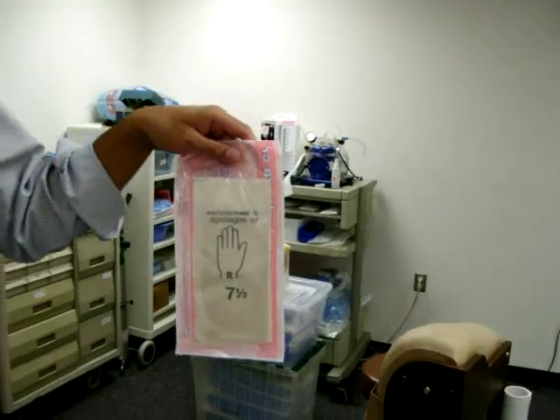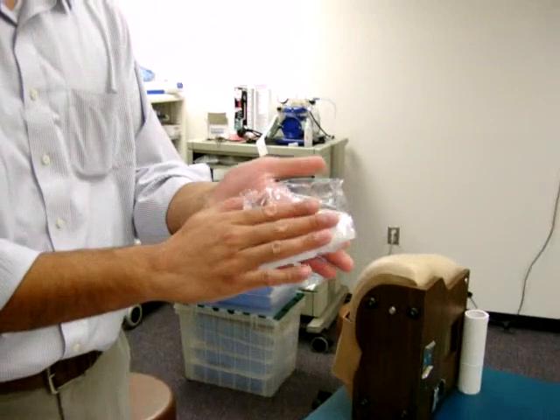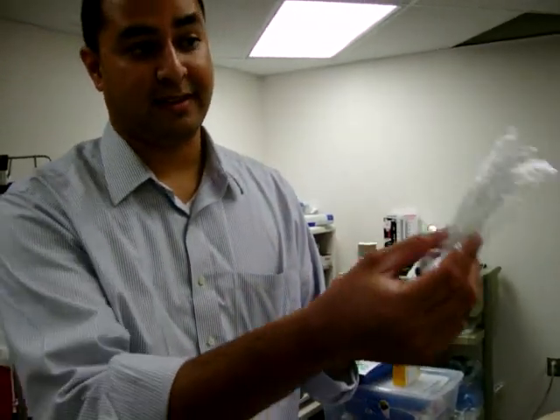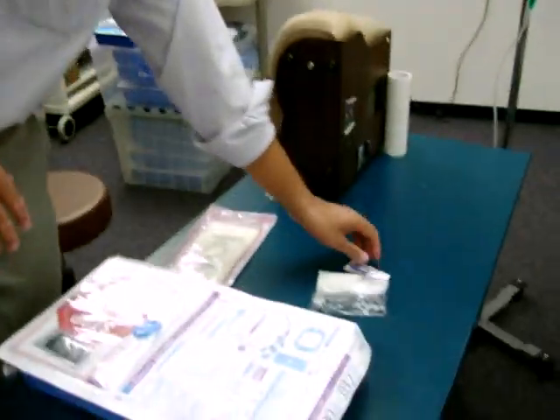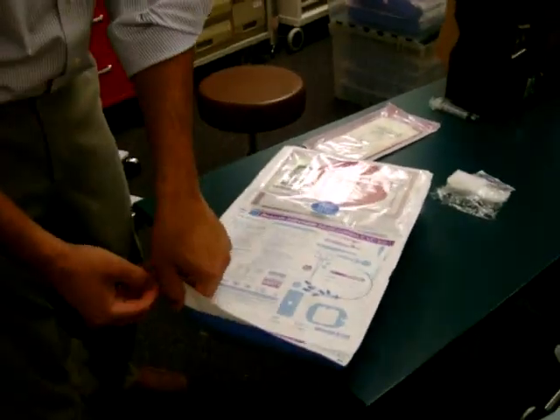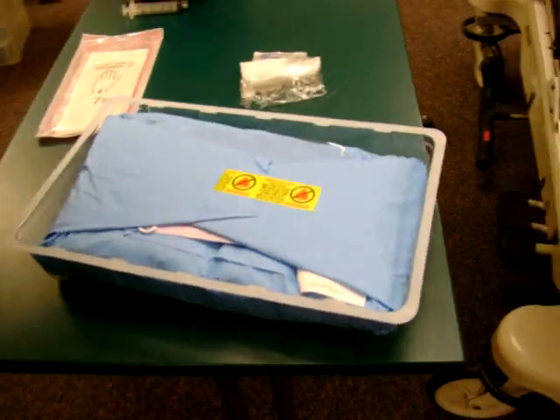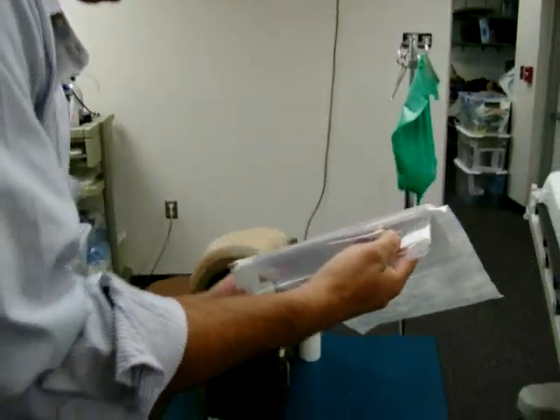You need sterile gloves — of course you're going to be doing a sterile procedure. This is also a probe cover which we're using; it will need to go over the ultrasound for us to put it into our sterile field. There would also be some sterile jelly. You can go ahead and open up your kit — you don't have to be sterile to do this. In the kit, be cognizant that there are some flushes that are going to be used later on in the procedure, so put those to the side.